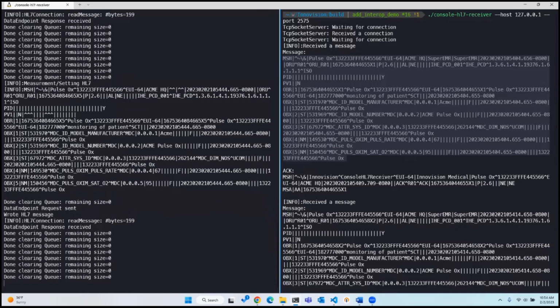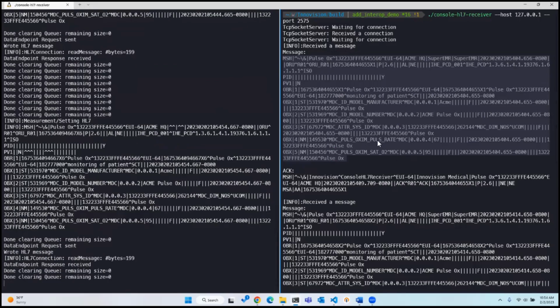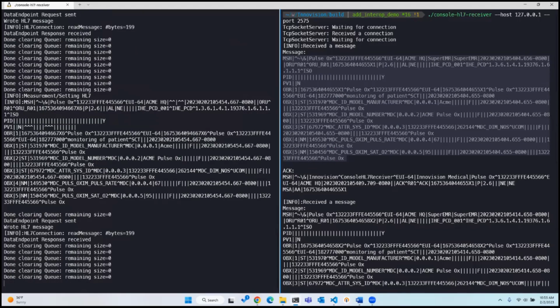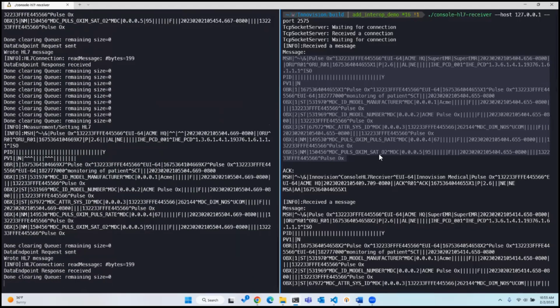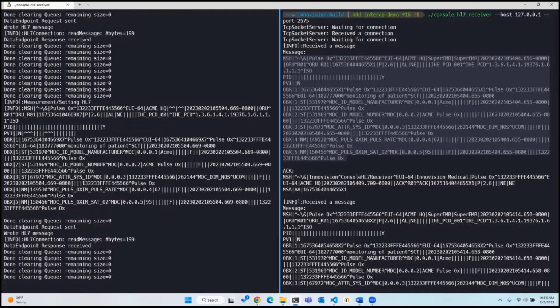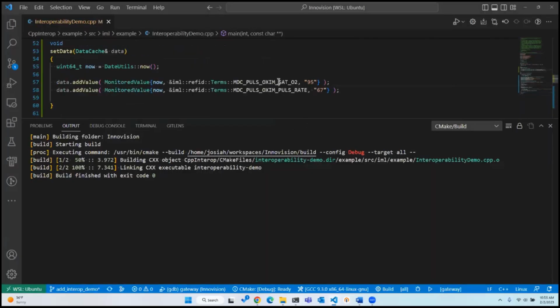So let's now validate the data. Down here is the pulse rate. And you can see that is 67, like we set it in the example. And our oxygen saturation, which is 95, like we set it in the example. I'll just show that. So here you can see oxygen saturation 95 and pulse rate 67.